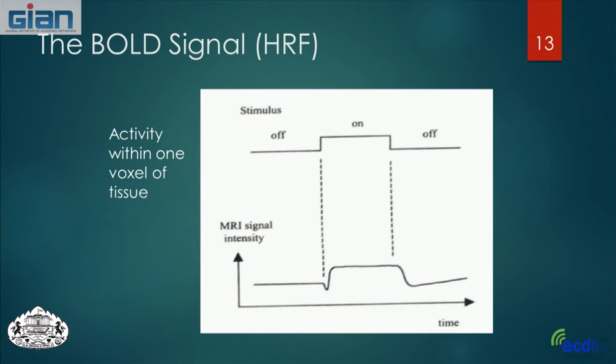So if we wanted to measure this change in our MRI intensity, we would see this effect following the same pattern that the bold signal follows. So we would see a slight change in our signal intensity, and then after the stimulus goes off, we would see it go back down again. So this is something, again, that we can measure, that we can see by comparing two different states over time in response to a person doing some kind of a functional task.